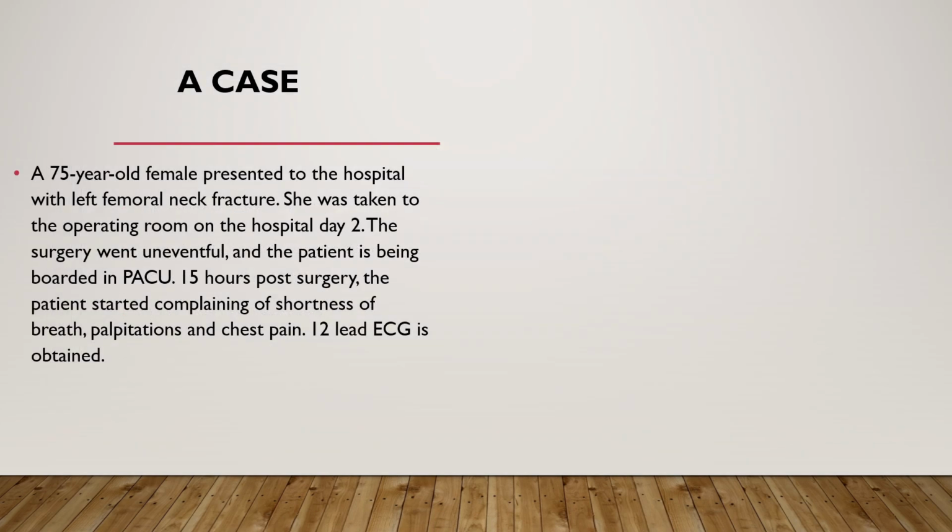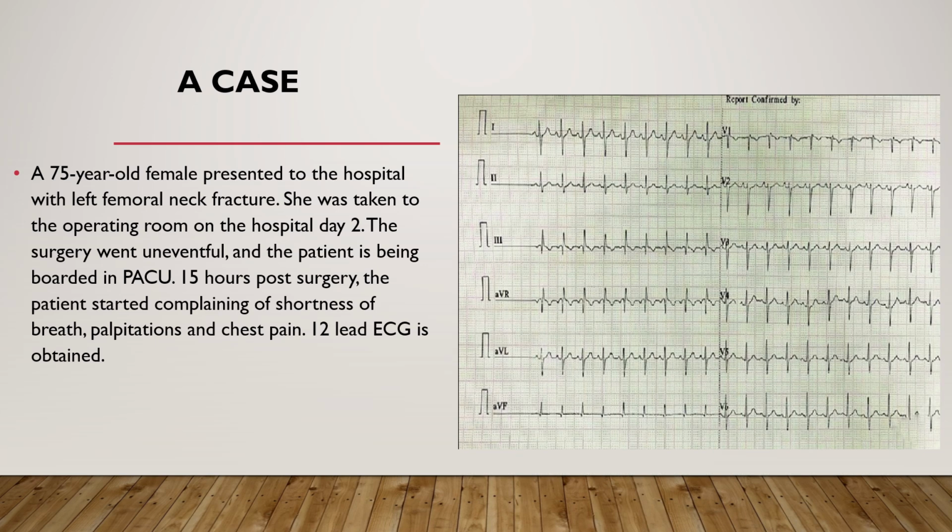Let's do a case. We have a 75-year-old female patient who presents to the hospital with left femoral neck fracture. She was taken to the OR on hospital day number 2. The surgery was uneventful, and she's being monitored in the PACU. About 15 hours after the surgery, she started having shortness of breath, palpitations, and chest pain. We decided to obtain a 12-lead EKG, which is shown here. Take a look and review this 12-lead EKG.